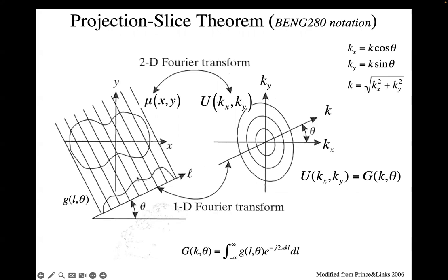And if I have my projection here, sorry that the notation's changed once again, but this is the projection here as a function of position on the detector and my theta. But if this is my object and these are the line integrals through the object like we've collected with our collimated detector, I just take that P(R, theta), take its Fourier transform, the one-dimensional Fourier transform, and it turns out, and we won't prove it or anything here, that one-dimensional Fourier transform is a sampling of the full two-dimensional Fourier transform of your object. And it's a sampling through that two-dimensional Fourier transform at this angle theta.